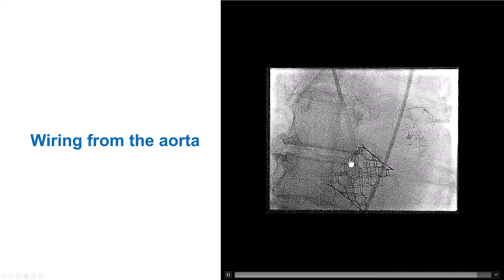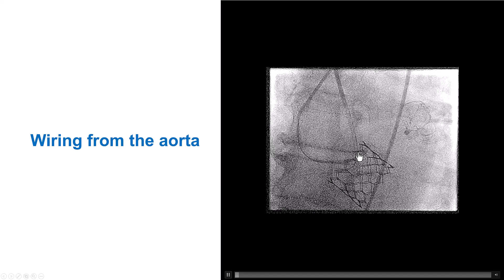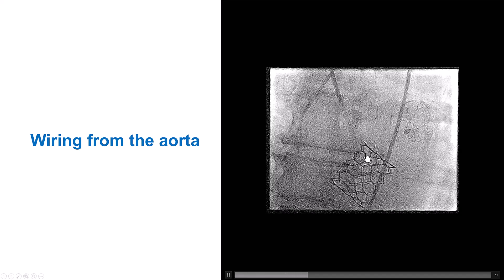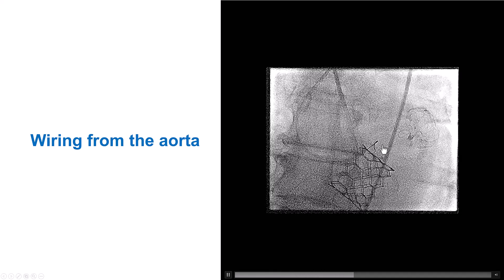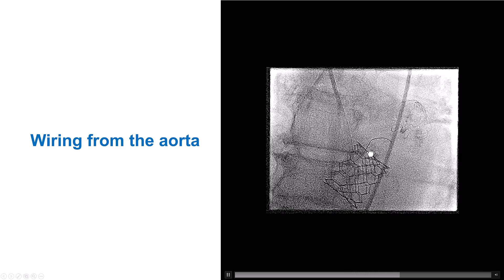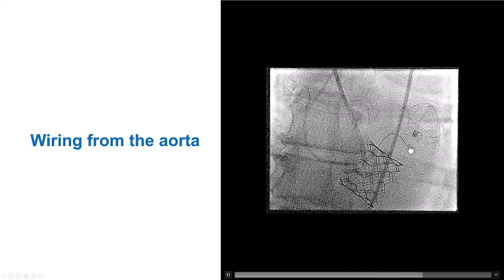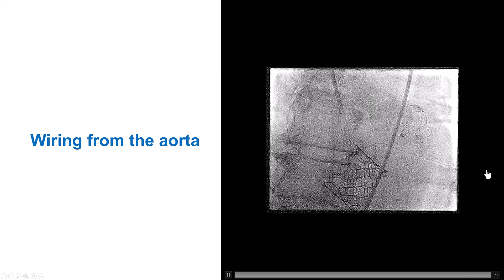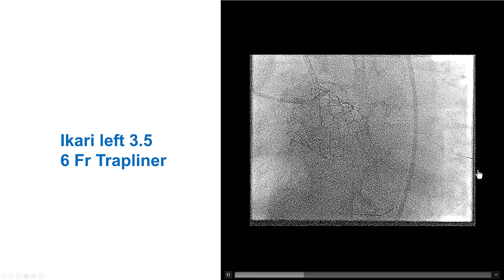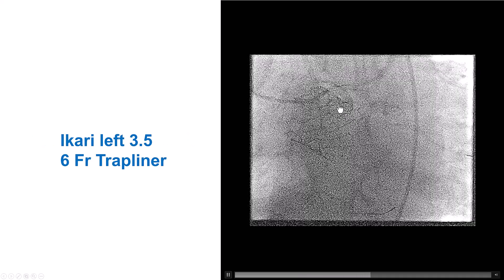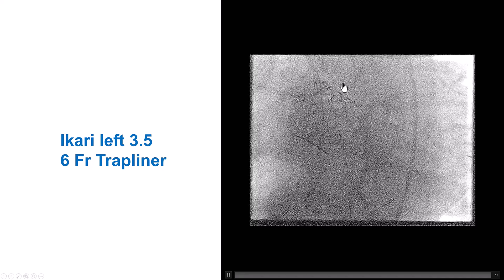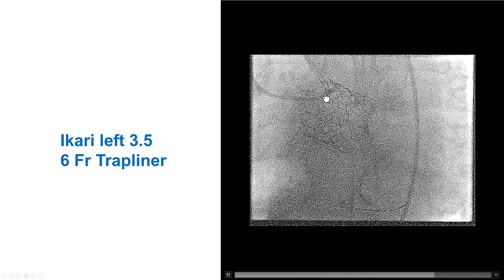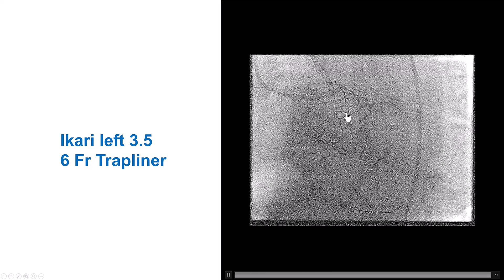Engaging the left main was challenging — we could not get the guide close, but we were able to advance a guide wire that went from the aorta into the coronary, appearing to go into the course of the circumflex. We then used a guide extension, which is essential for engaging vessels in patients with previous TAVR. This was a Sapien valve.